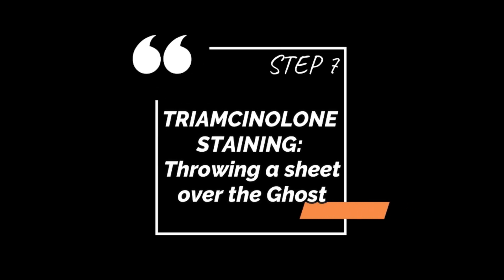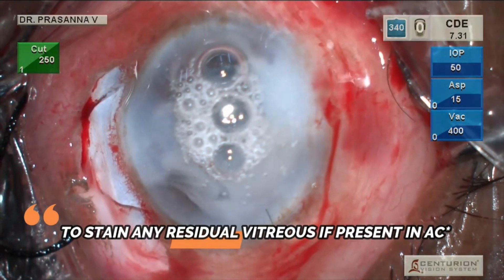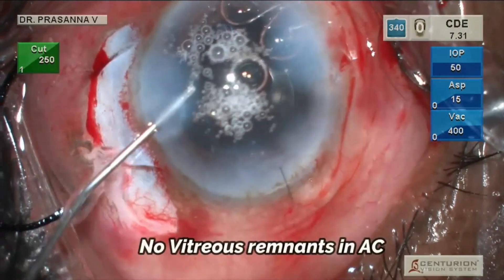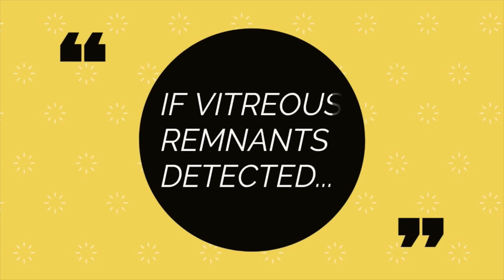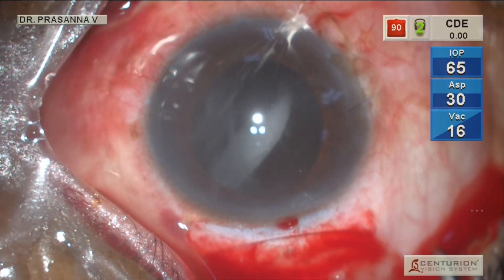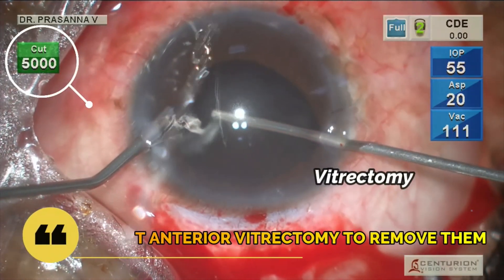Diluted triamcinolone staining is a simple technique to identify vitreous. Even if one does not use it before initiating anterior vitrectomy, it is good practice to use it at least before final closure to avoid missing any vitreous strands. If vitreous tags are detected, one must reinitiate anterior vitrectomy and clear them to avoid post-operative complications.